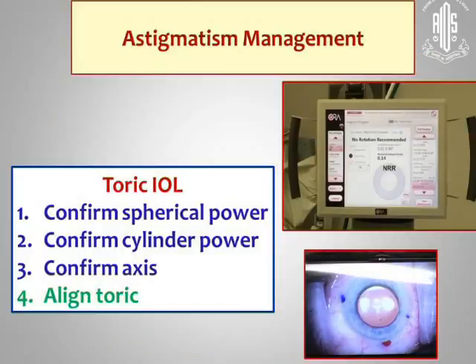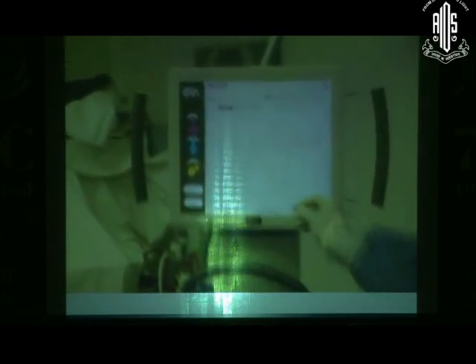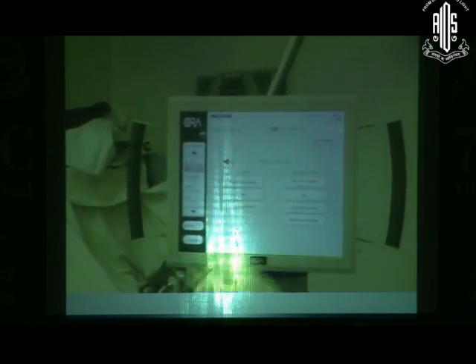So what it does is you do an aphakic reading, and that's my chance one more time to use this as a tiebreaker. Did I want a T4 or a T3? Did I want an 18 or an 18.5 diopter? It will basically make a suggestion, and I can use it as a tiebreaker. So here's a toric lens. You see the marks. And then I go over to the Aura system, and I'm going to now do an aphakic reading. And this is unedited, so you can see in real time how much faster it is.